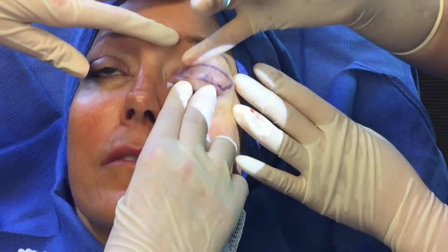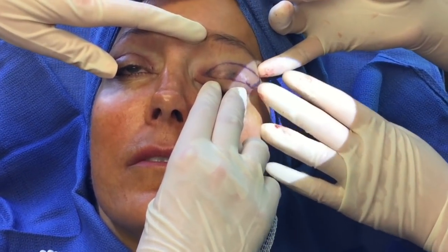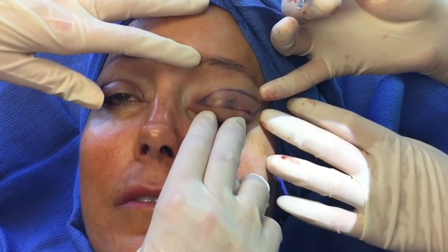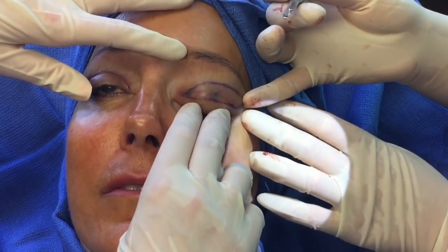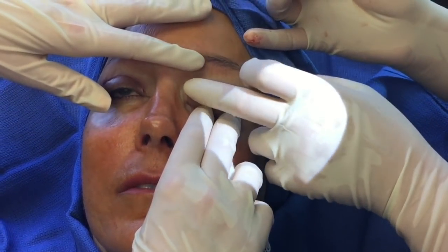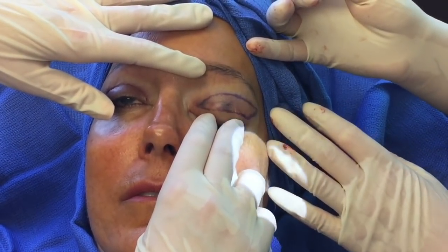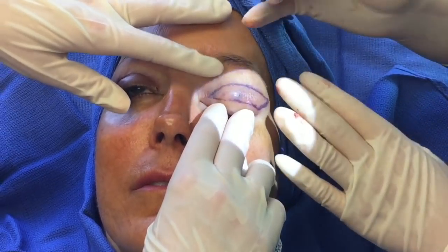Now we're going to start with the left side. You can see the incision comes up at the end towards the outer corner of the eye to take care of the excess skin and lateral hooding. In this patient she really has no fat, so I'm not removing any fat today. But on some patients they get a bulge and puffiness right here, and I'll remove a little bit of fat that causes that bulge — also done in the office.